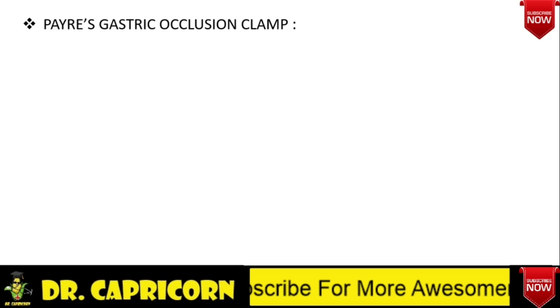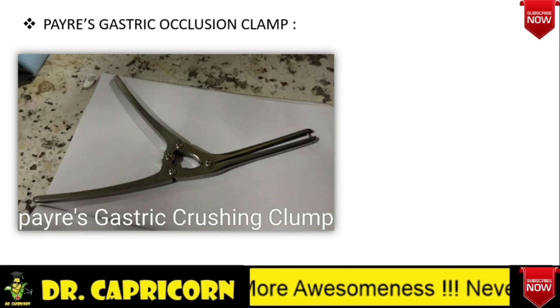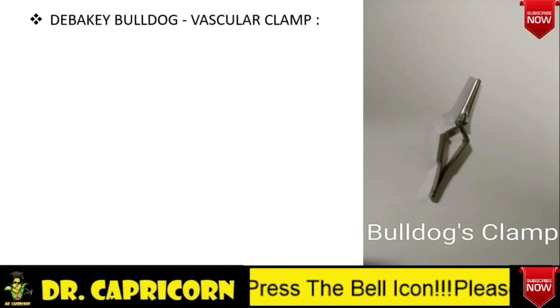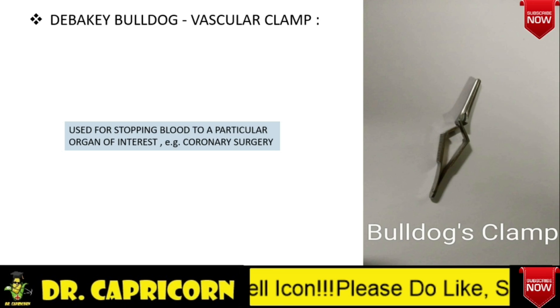Payer's Gastric Occlusion Clamp — it is important to first identify the instrument. In this clamp, there are no finger rings present. It is used to crush the diseased part of gut during resection and anastomosis. DeBakey Bulldog is a vascular clamp used to stop the blood to a particular organ of interest, so that a less vascular field is obtained and chances of blood loss can be minimized — for example, in coronary surgeries.